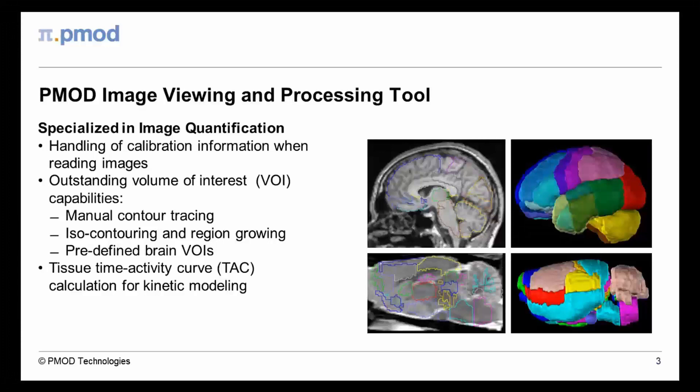One of the major strengths of the PMOD viewing tool is the wealth of methods for definition of three-dimensional volumes of interest. These methods range from manual contour tracing and isocontouring to the adjustment of predefined brain VOIs.